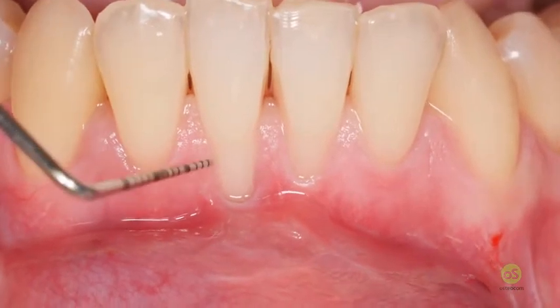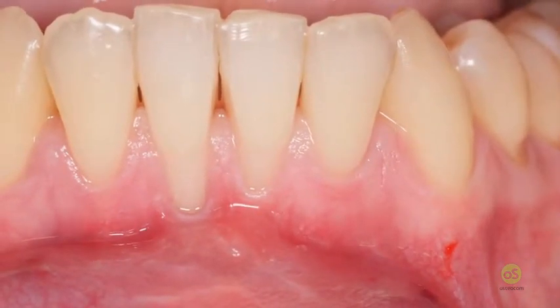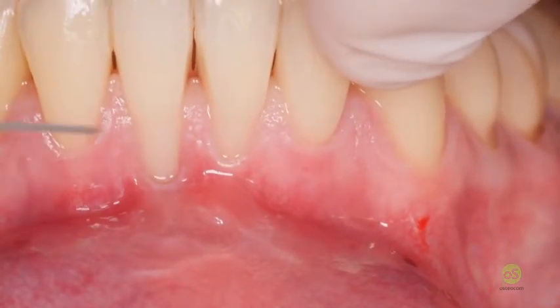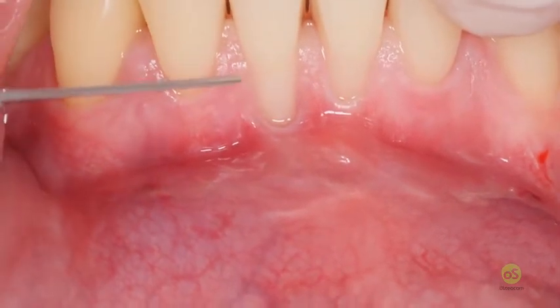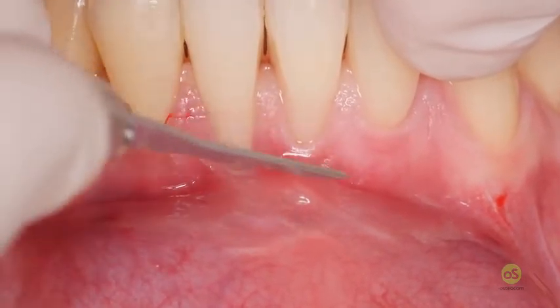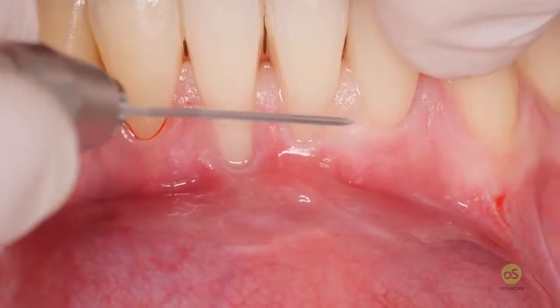And the more apical you make the incision, the less keratinized tissue you can keep in your papilla. So what I'm doing in the lower incisors is to keep the incision where there is the best quality of keratinized tissue, interdentally. So I'm looking at where the keratinized tissue is from here to here, and I will make the incision where I can find the best quality of keratinized tissue. Here and also here, the area where there is a good amount of keratinized tissue is not good. The best area is this.